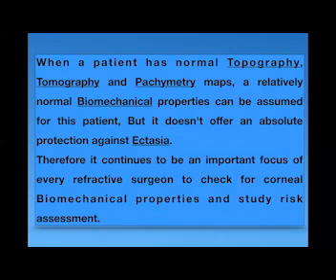If you have a mild risk in the topography, which may be related to surface irregularities or surface abnormalities or false negatives, false positives, you can have another proof that this is the background, and we have to care about the corneal biomechanics again and consider it.